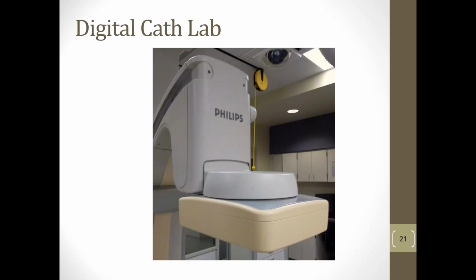Interestingly enough, this room is the same age. This room was installed in 2005. However, it has the flat panel image detector that is 100% digital. So the comparison and contrast of the old technology versus the new technology really coexisted for quite a while.